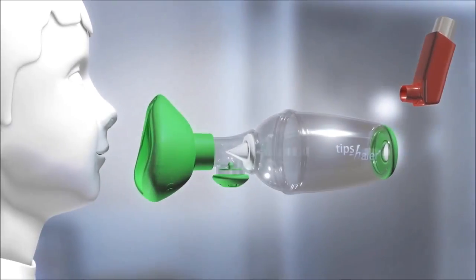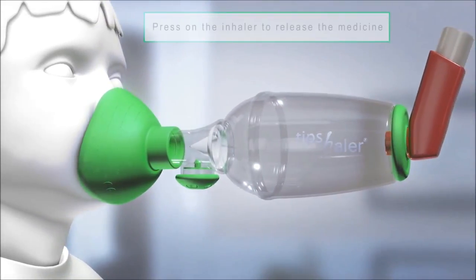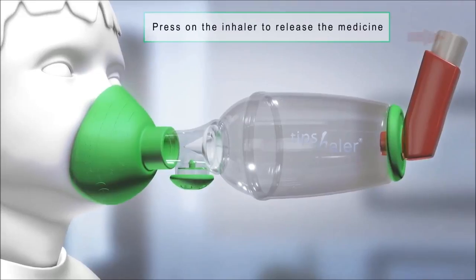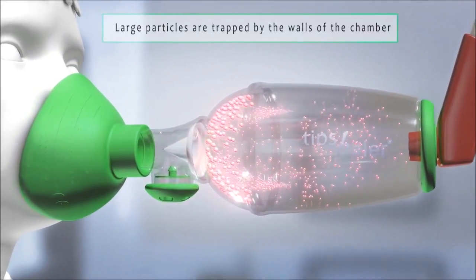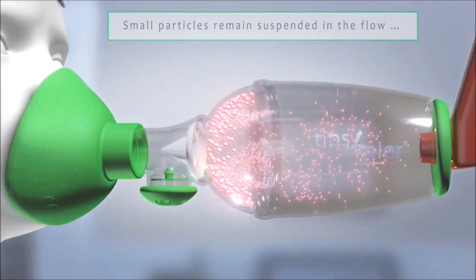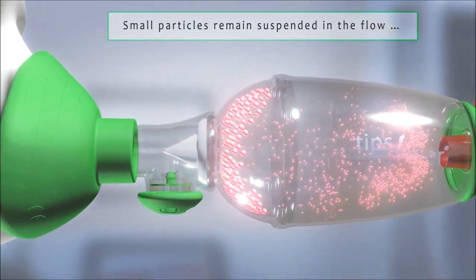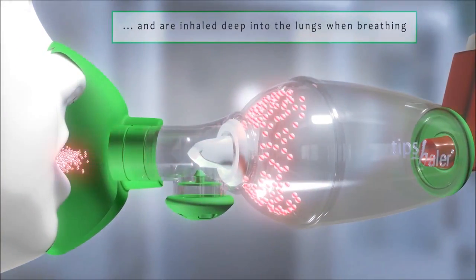Metered dose inhalers release particles of medication in the chamber in an aerosol form. Tipshaler walls quickly catch large particles and avoid impacting the mouth and throat. Meanwhile, small particles remain suspended in the flow. Selected through Tipshaler and its ISOBreath valve, small particles are inhaled deep into the lungs where their efficiency will be maximum.